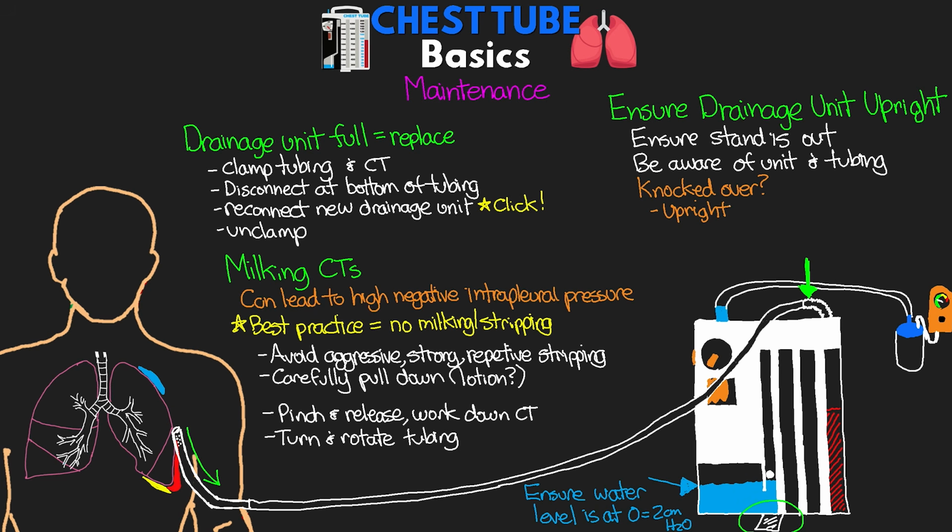At this point, we want to be checking the integrity of the system. So make sure that you have enough water and at the appropriate level in your water seal. You also want to keep an eye on your drainage levels. Now, a lot of the units will actually allow you to tip the unit to the side. This is going to facilitate the drainage going back into the appropriate chambers that they're supposed to be filled in first.